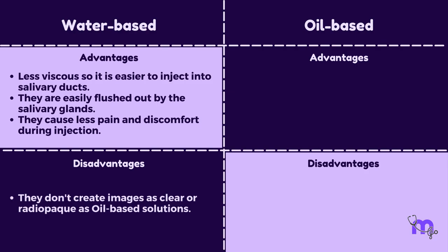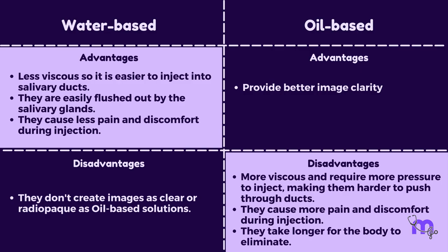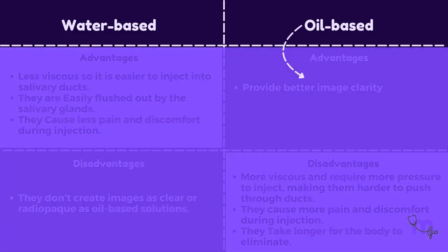Now, although oil-based solutions provide better image clarity, they are more viscous and require more pressure to inject, making them harder to push through ducts. They cause more pain and discomfort during injection, and they take longer for the body to eliminate. Ethiodol is an oil-based contrast media.